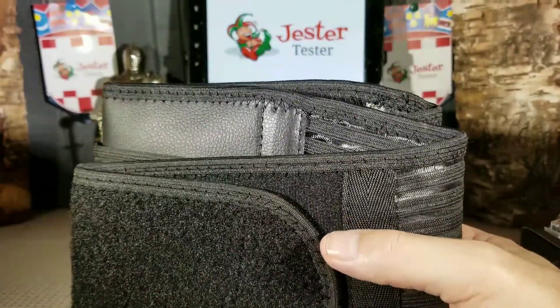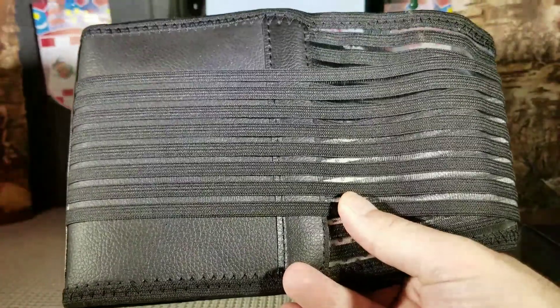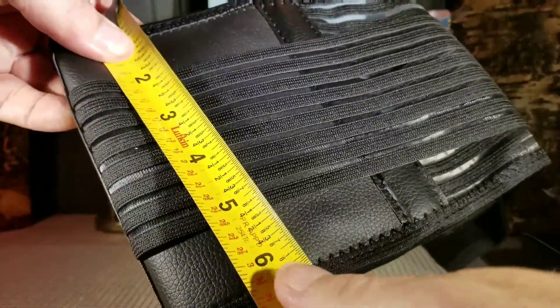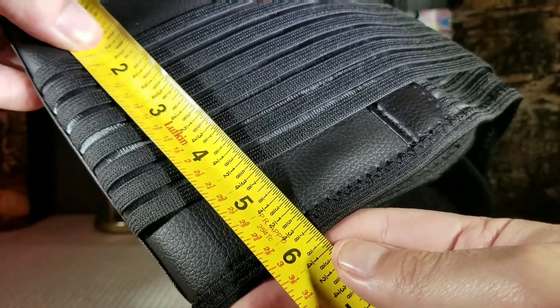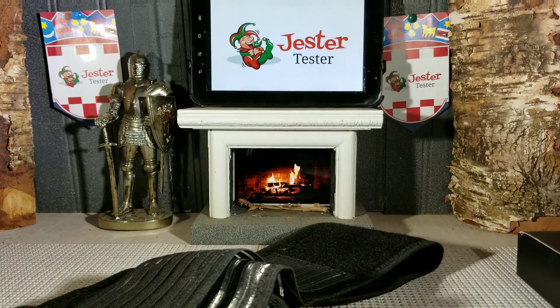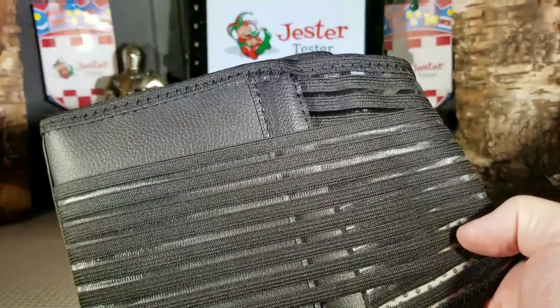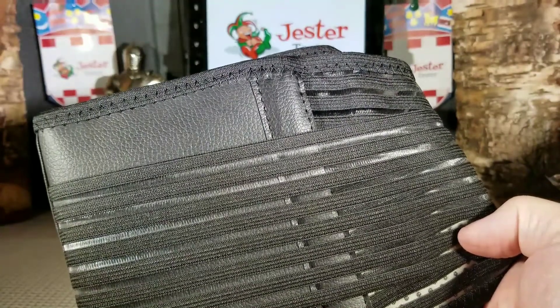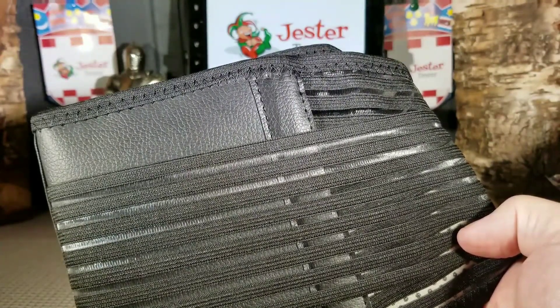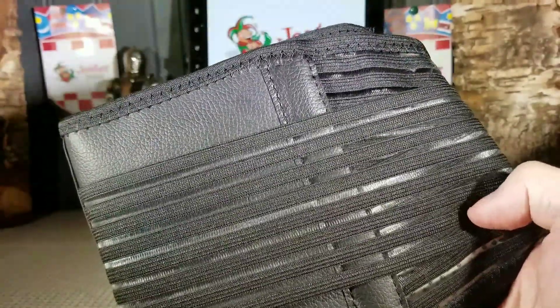First off, one of the greatest reasons I like this is because of the width of it. I had another back brace, and if you see here, it's not very wide at all. The total width on it is just about 5 and 7 eighths inches — that's not very wide for a back brace. A lot of braces are made extremely wide, but the problem is around your stomach area, when you have a wider belt, it's harder to sit down with it. It's great when you're standing, but if you have to sit with it and it's really wide, it's very tough. You basically have to keep taking it off and putting it back on. But this one is really comfortable to sit in because it's not that wide.